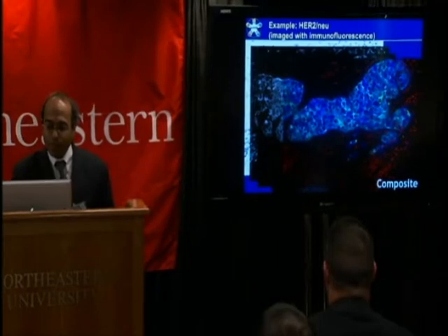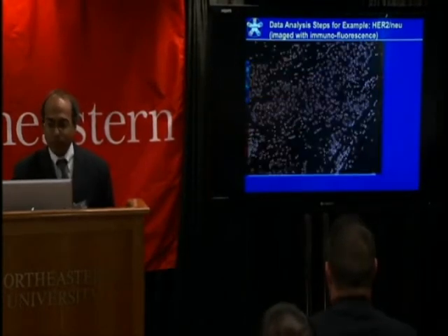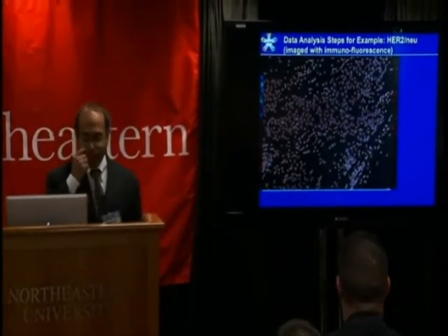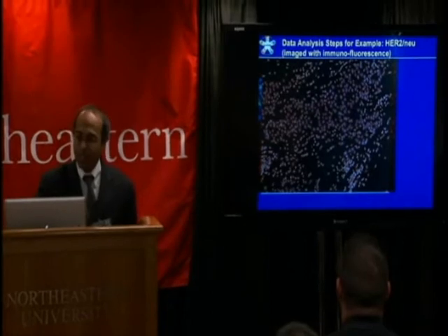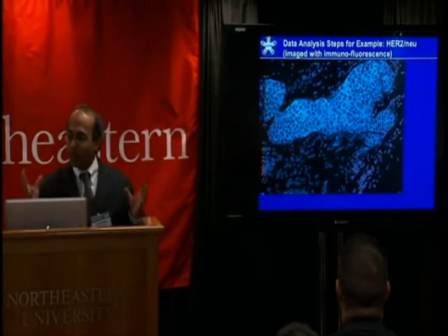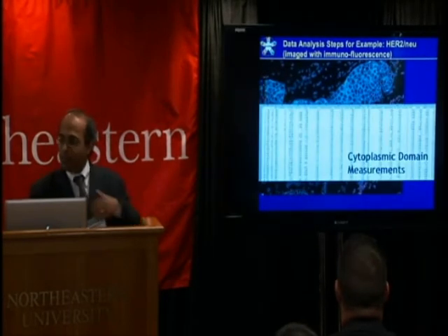So basically, one of the things we did as academics is said, okay, we were going to build a software system that'll go off and make sense of this data. So we built an algorithm that can segment all the cell nuclei. This is a surprisingly hard problem, actually, to delineate all the membranes, essentially delineate all the cells, and make measurements of all these cells. That's the essence of anatomic pathology. You're trying to get at structure.